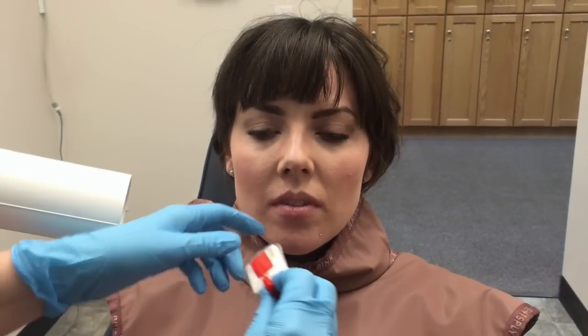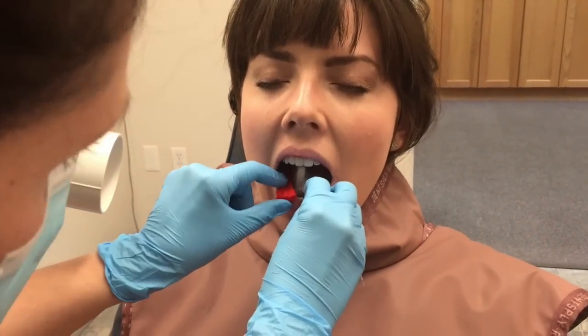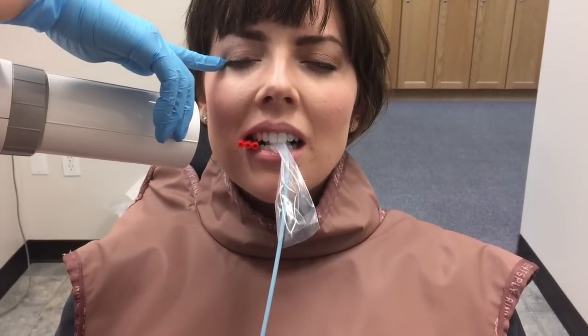To place the molar digital bitewing, you're going to place it between the tooth and the tongue. As she bites down slowly, you're going to push it back farther — you can't push it back when their mouth is so far open. Then line it up like normal. I have the center of the cone aligned with the corner of her eye for the molar shot, then I'll expose it and come back.